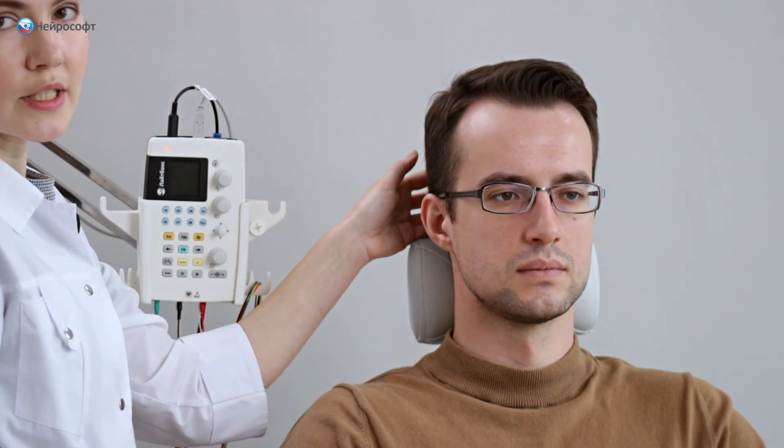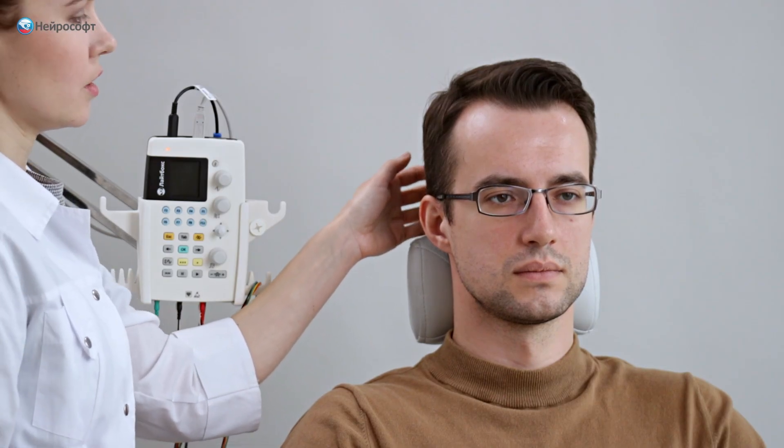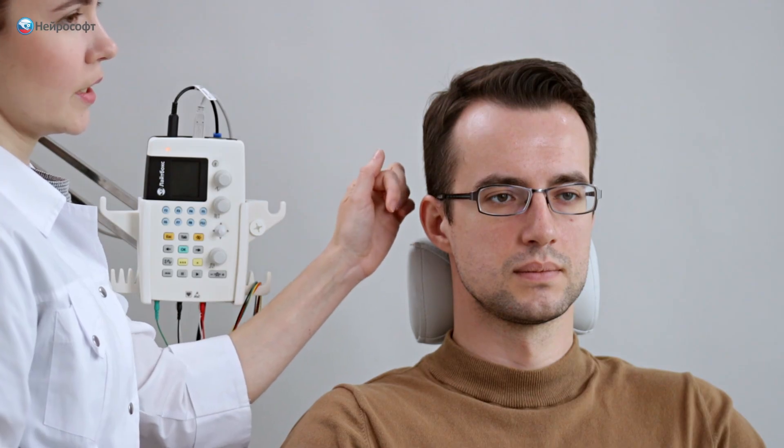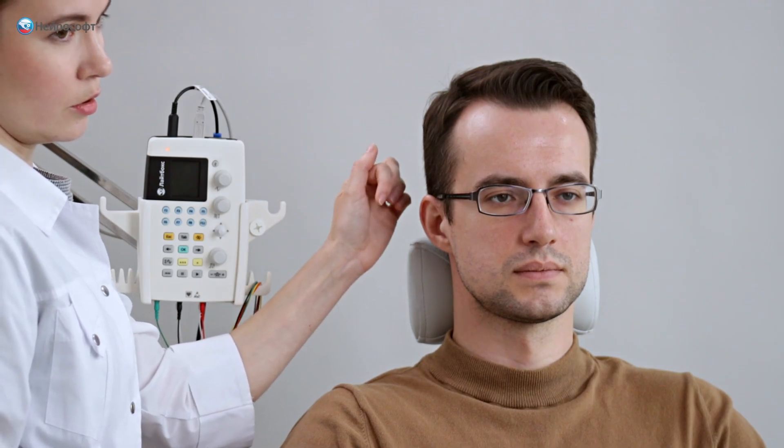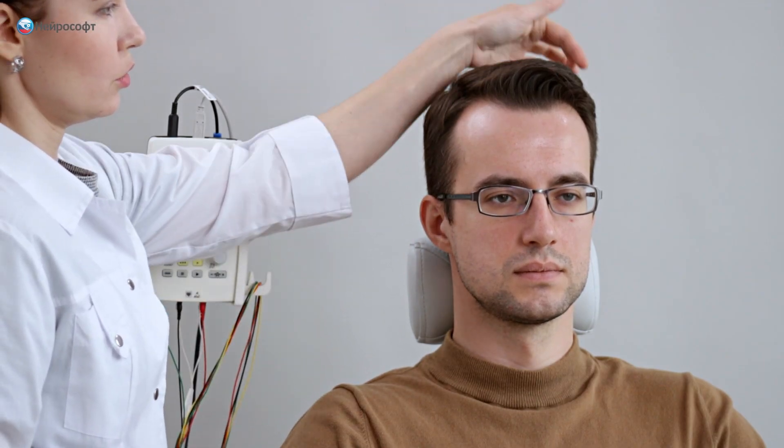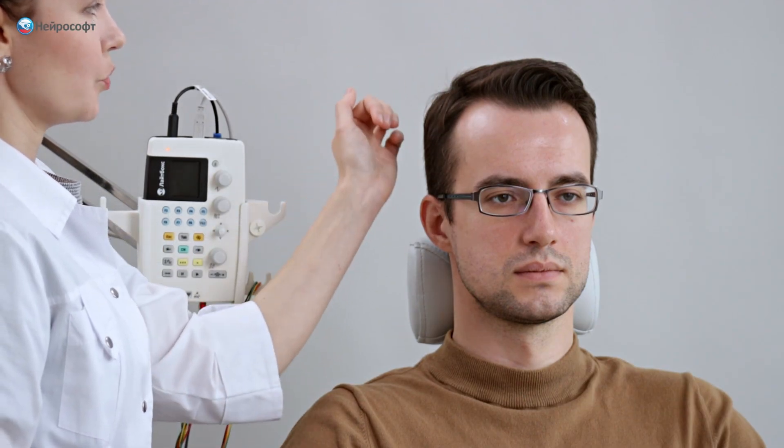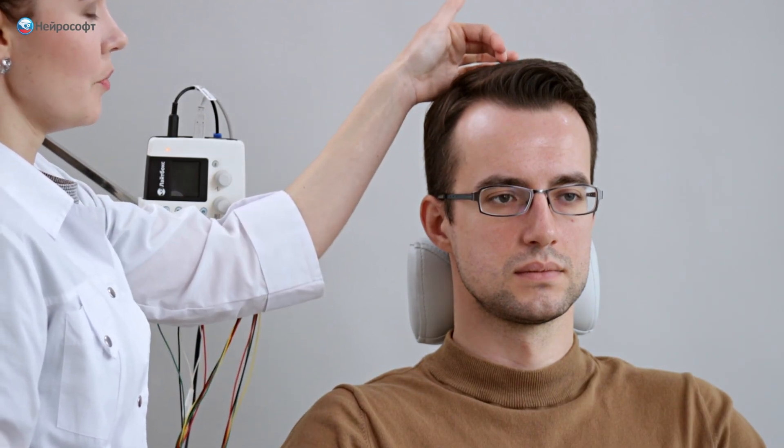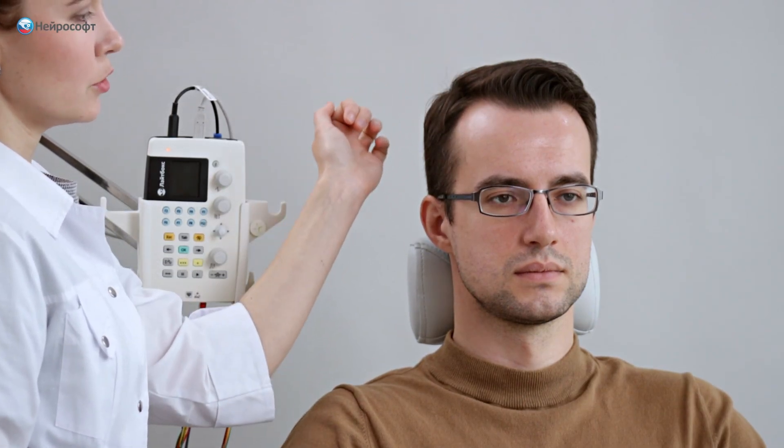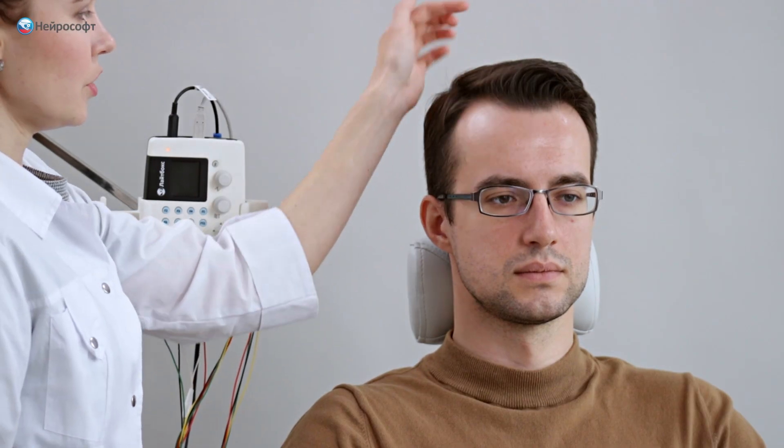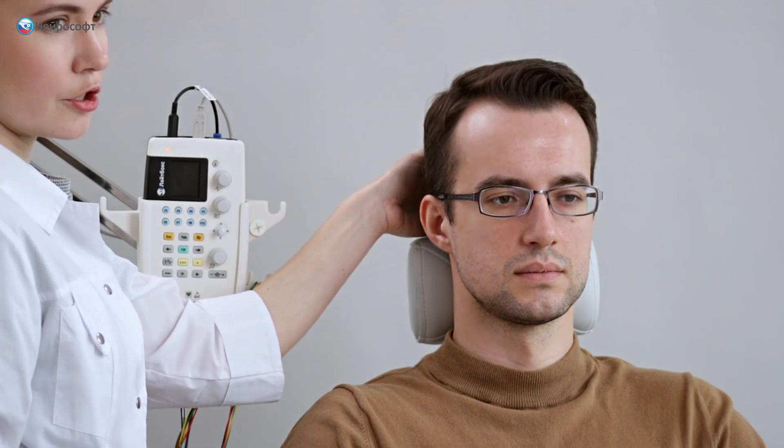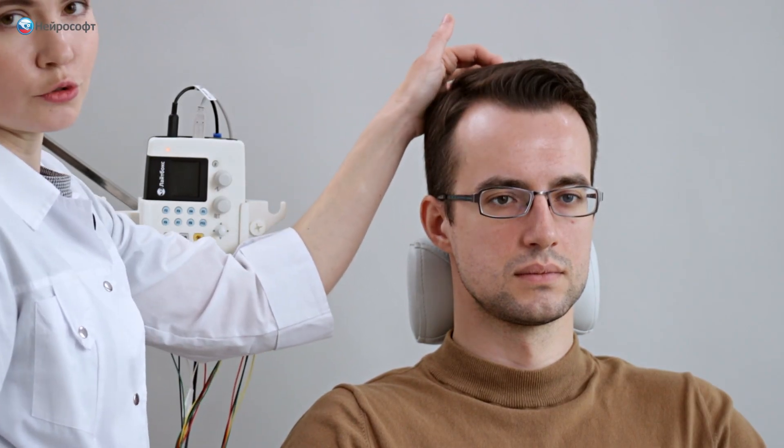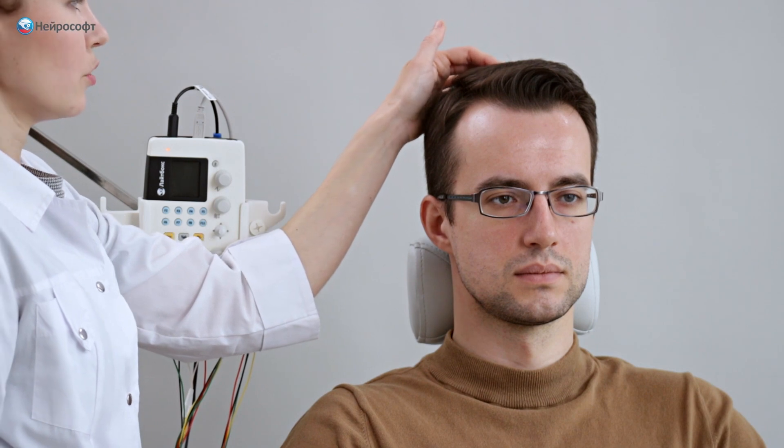The reference electrode will be positioned at the CZ point or vertex according to the International 10-20 system. To determine the CZ point, we find the distance from the external ear canal on one side to the external ear canal on the opposite side, divided in half, and also find the distance from the bridge of the nose to the occipital protuberance, divided in half. At the intersection of these two lines, we get the vertex point.